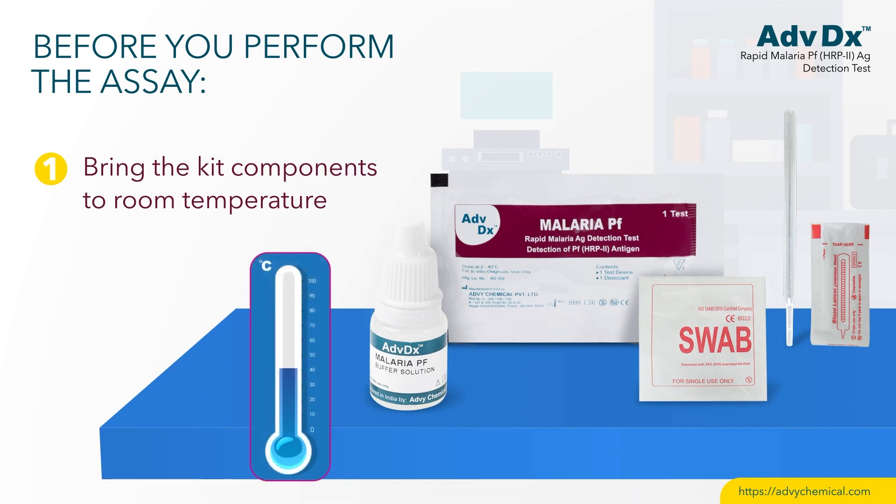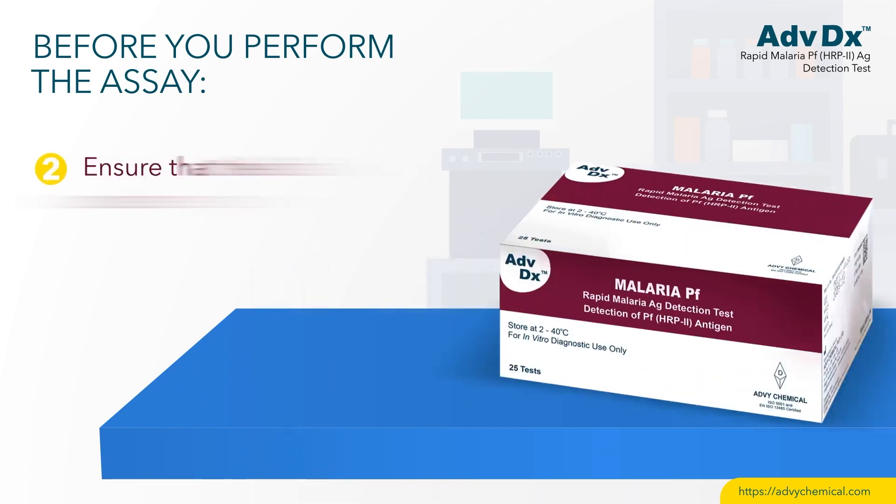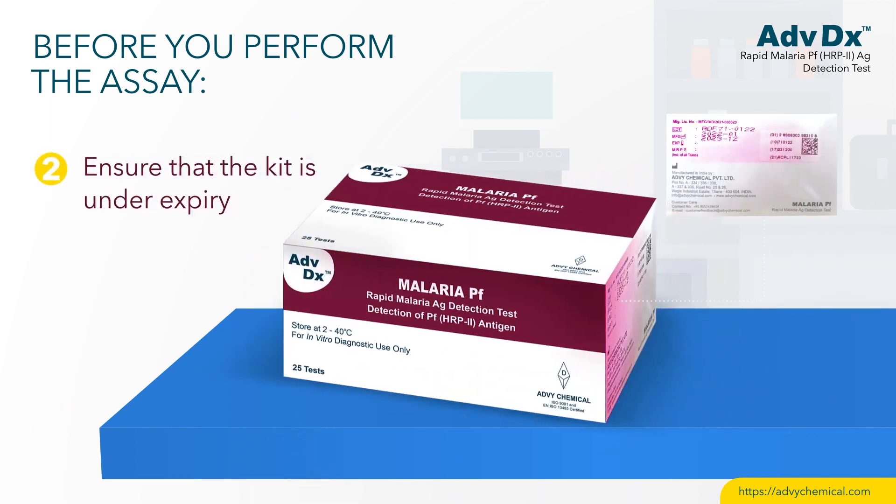Before you perform the assay, bring the kit components to room temperature. Ensure that the kit is under expiry.